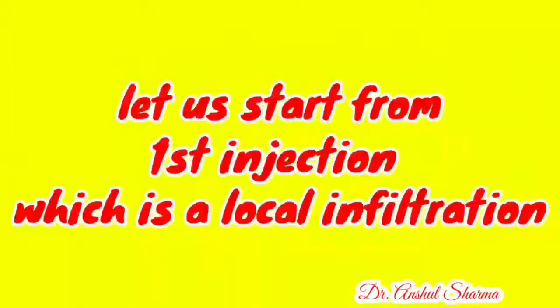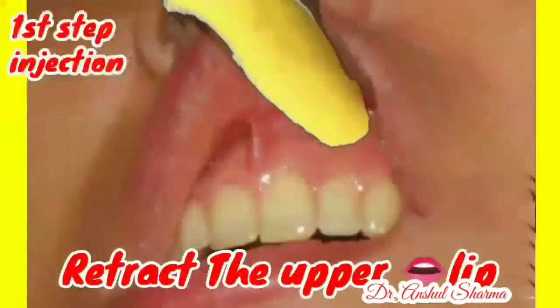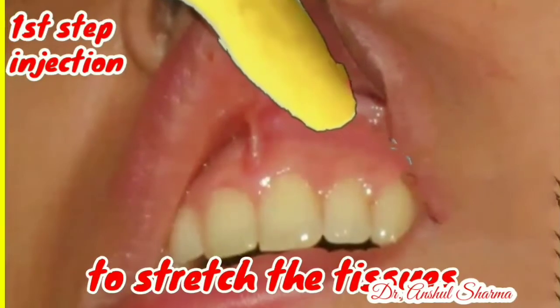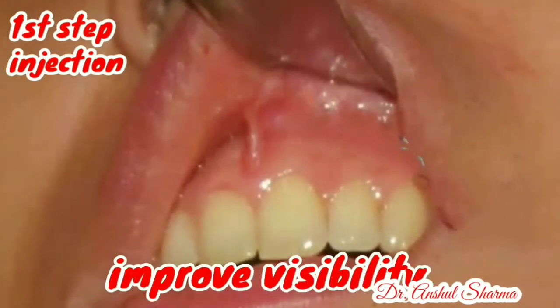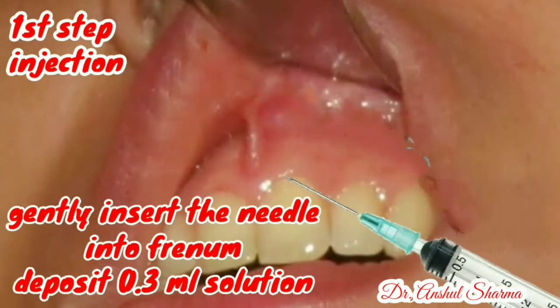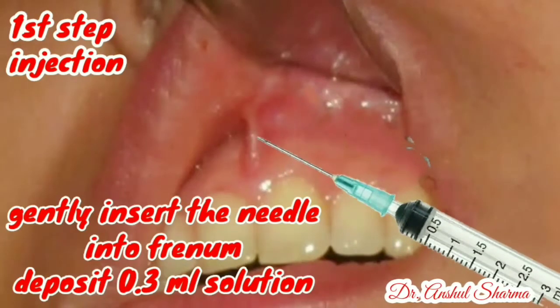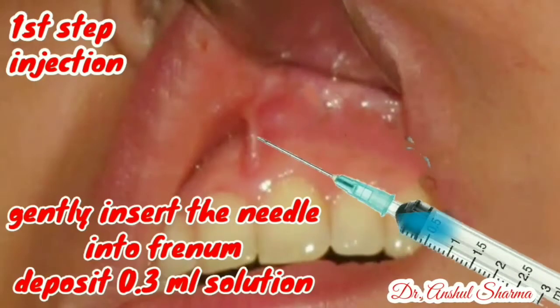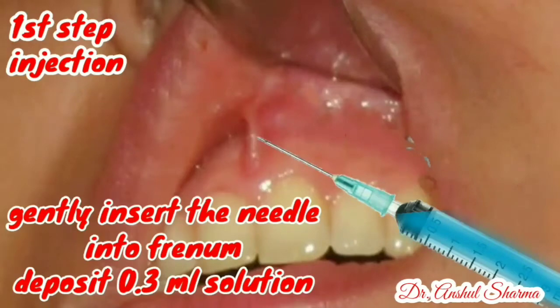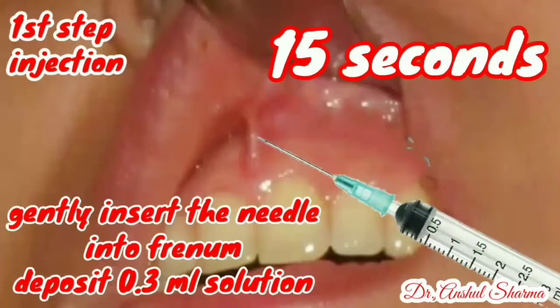Starting with the first injection, which is a local infiltration injection: retract the upper lip to stretch the tissues and improve visibility. Gently insert the needle into the frenum laterally and deposit approximately 0.3 ml of anesthetic solution in approximately 15 seconds.